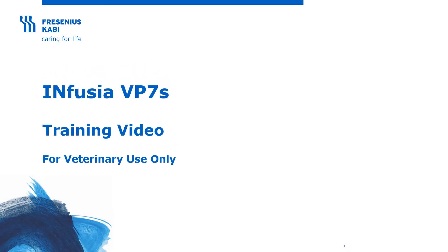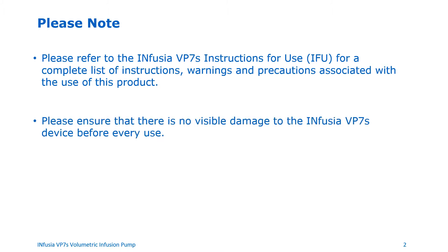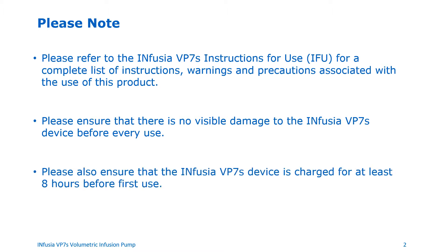Infusia VP7S training video. This product is for veterinary use only in the United States. The purpose of this video is to provide training on the use of the Infusia VP7S volumetric infusion pump. Please refer to the Infusia VP7S instructions for use for a complete list of instructions, warnings, and precautions associated with the use of this product. Please ensure that there is no visible damage to the device before every use, and that it is charged for at least eight hours before first use.